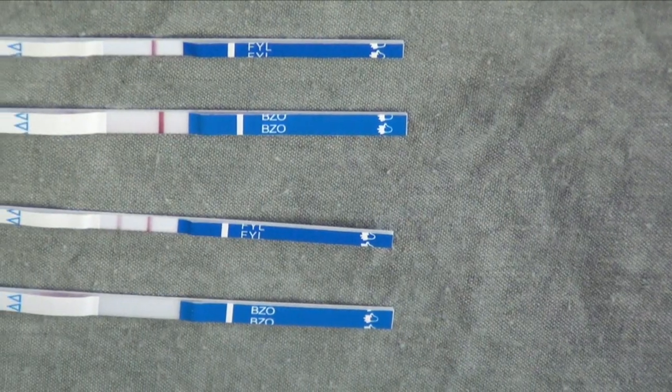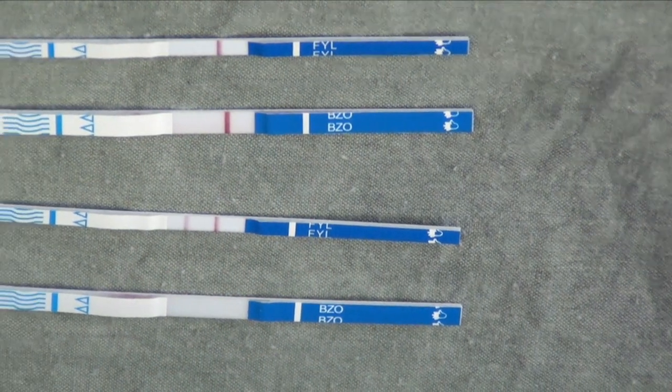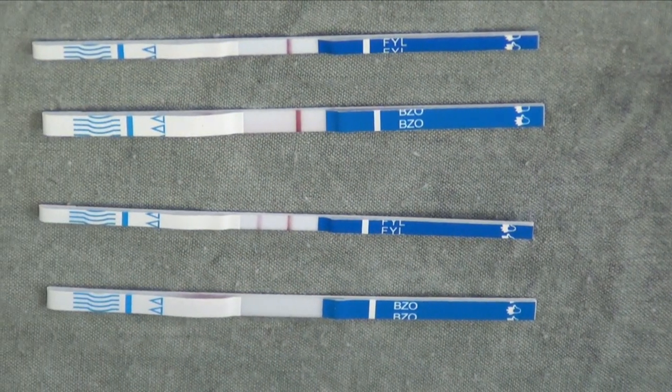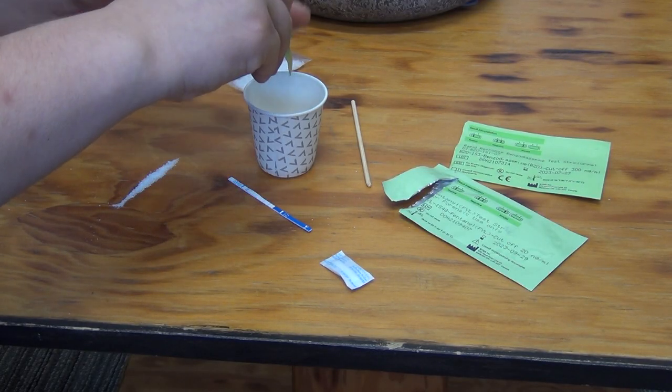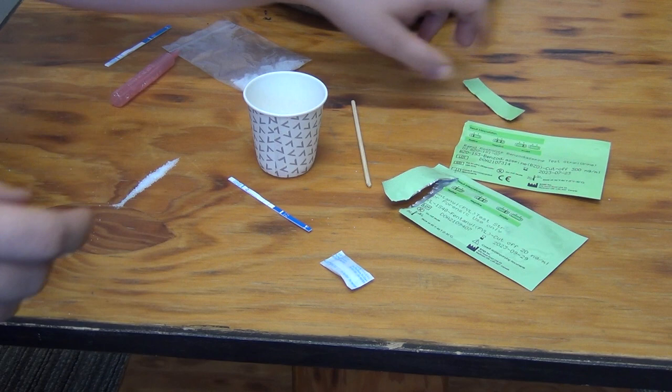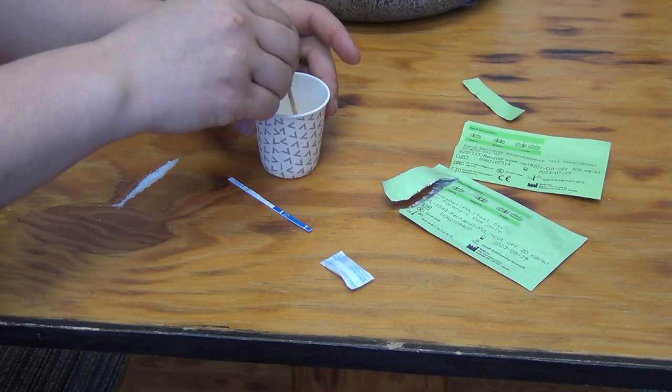If no lines are visible, as seen here on the benzo strip on the bottom, or only one line is present on the same side as the blue squiggly lines, your test is considered to be invalid. You will have to get a new strip and test again as the strip you've used may be defective.